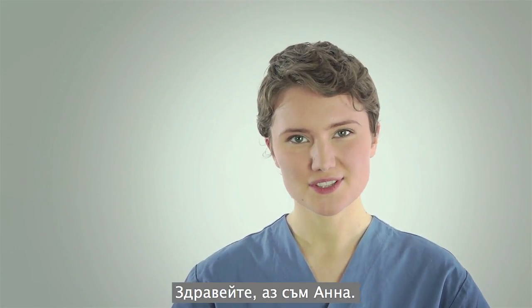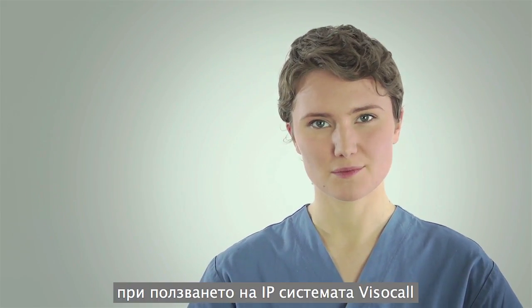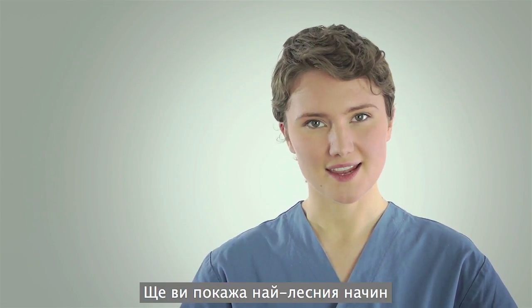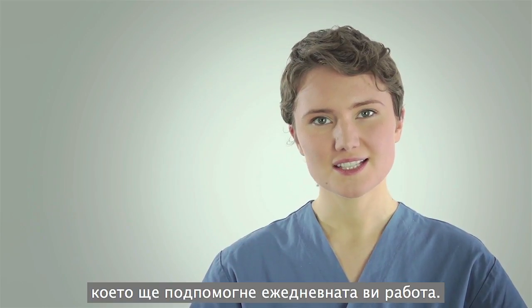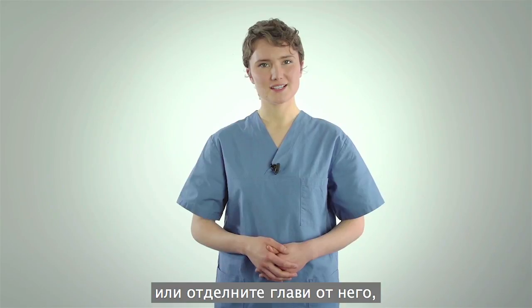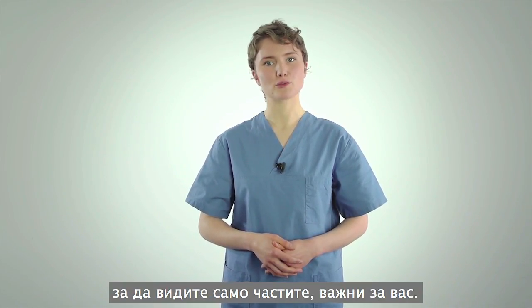Hello, I'm Anna. I'd like to introduce the most important features of the Visocall IP system from Schrack Seconet. I'll show you the easiest way to operate the various devices that can help you in your daily work. You can watch the entire film or access individual chapters to see just the parts that are important for you.